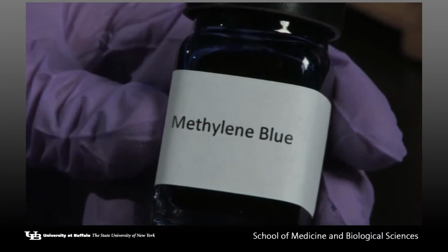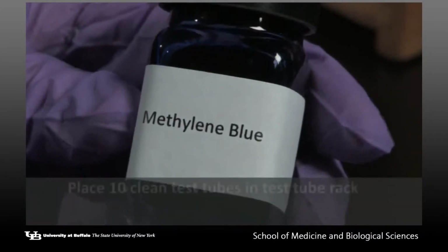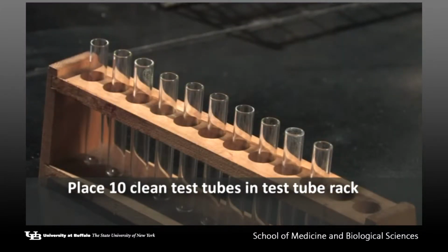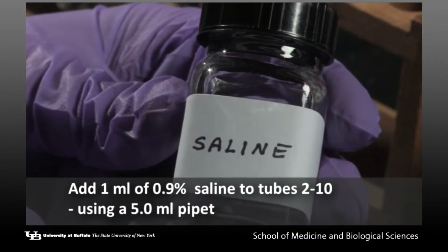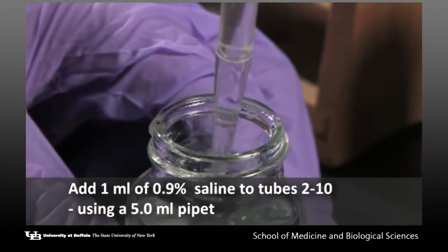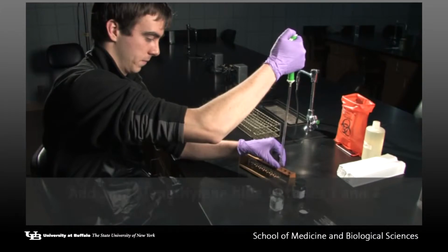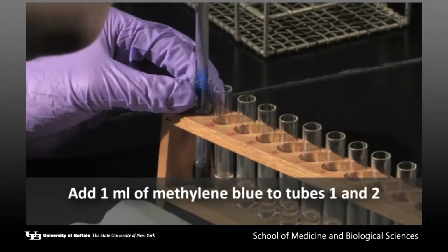A substitution of methylene blue for the patient's serum is made for this demonstration. Place 10 clean test tubes in a test tube rack. Add 1 ml of 0.9% saline to tubes 2 through 10 using a 5 ml pipette. Add 1 ml of methylene blue to tubes 1 and 2.